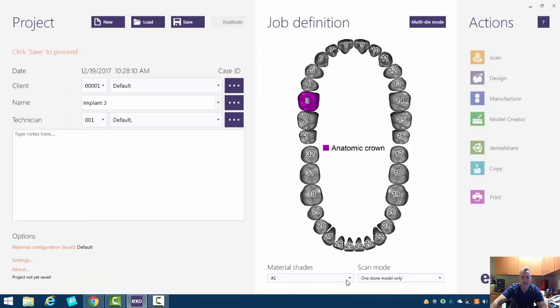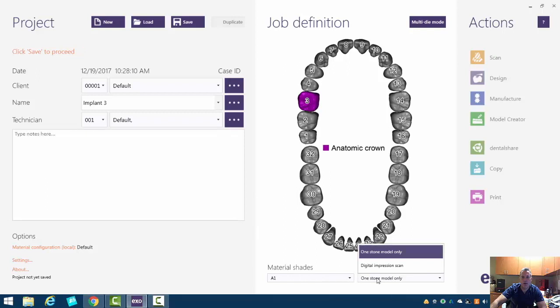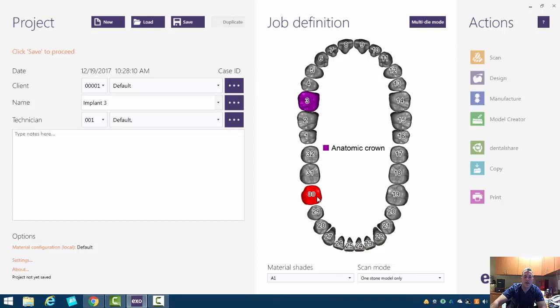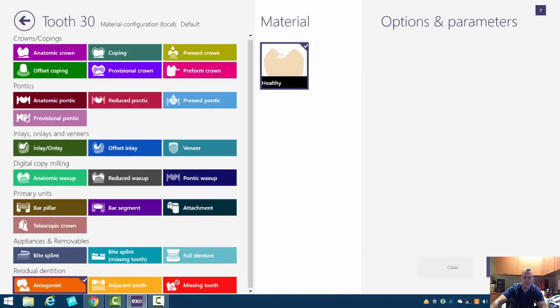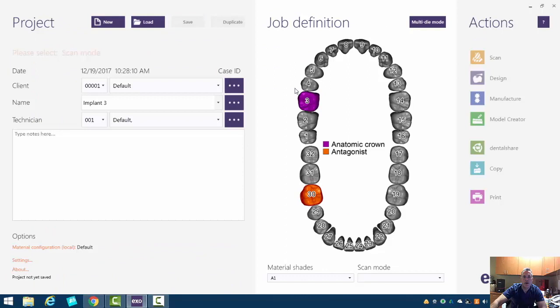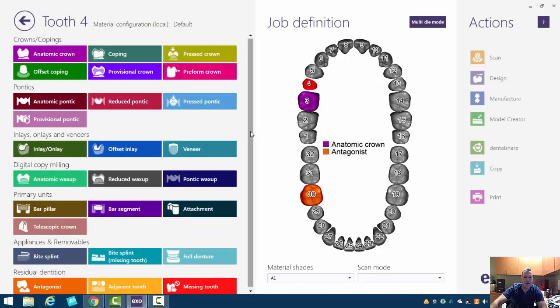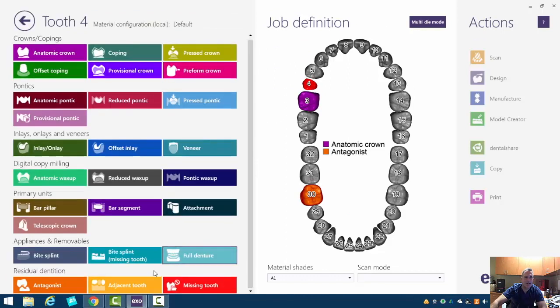Now we're also going to tell ExoCAD that we want to use an opposing arch. And so to do that, we just click on the opposing arch and tell it that we have an antagonist. Also, we may want to tell this that we have adjacent teeth.